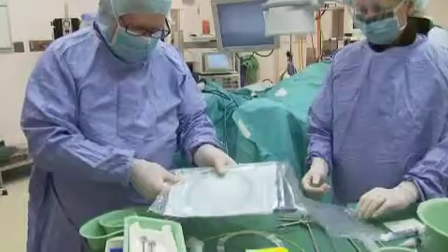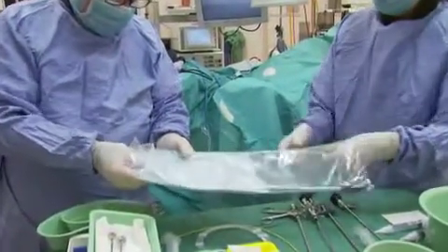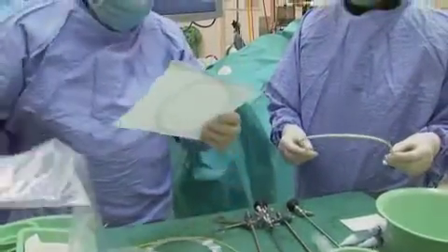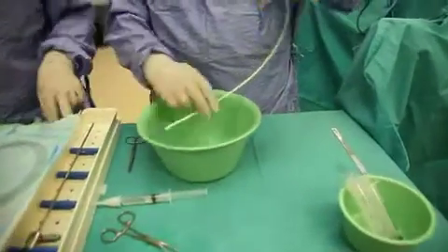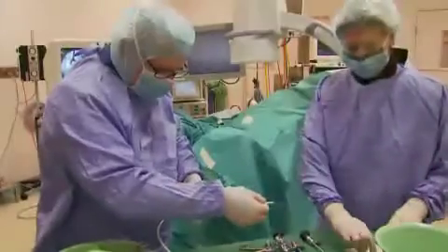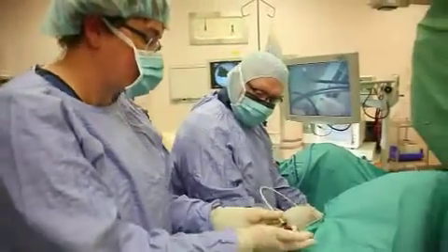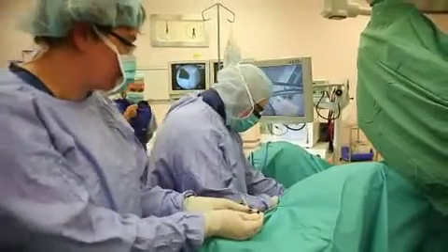We have determined the length of the Memokath that we will be using in this case, and now we are opening up the packages. This package, we have the ureteric sheath dilator. We will immerse the ureteric sheath dilator in the water, and also we will use some KY jelly to apply over the sheath so that it slides easily over the guide wire. I am now passing the sheath over the guide wire.